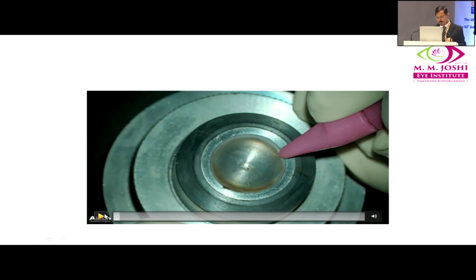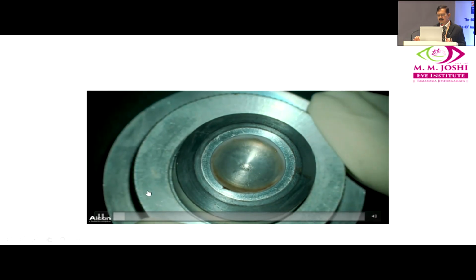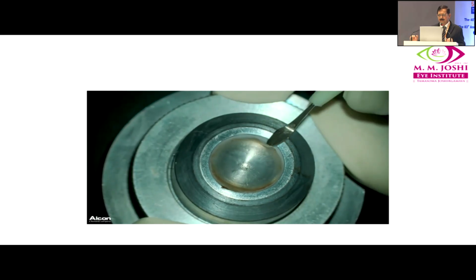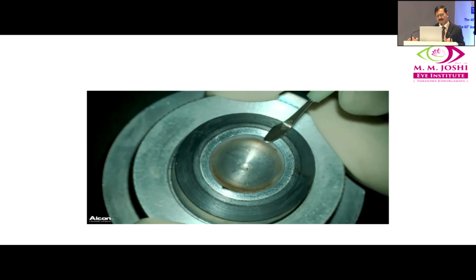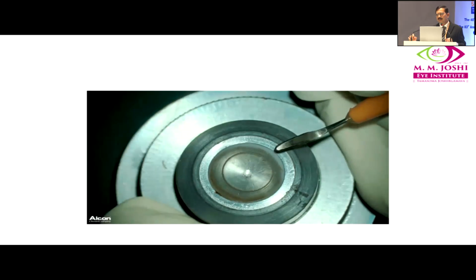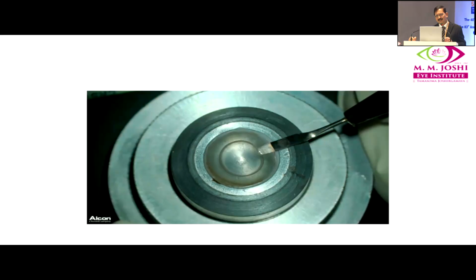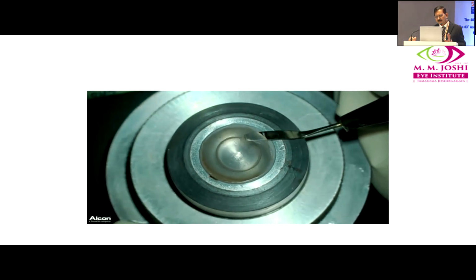So once you dissect this, so now you have made a cleavage. Now you are going to make a plane. This is exactly at the 400 microns. So better to lift the tissue and then you start there. And this is the dissector. So this is a disposable dissector.